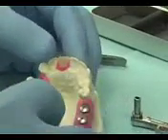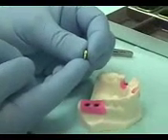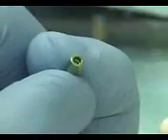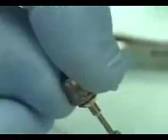What I'm going to do now is, in like manner, remove the healing abutment from our wide neck implants. Now the one difference between the wide neck and the regular neck solid abutment is the wide neck abutment is large enough on the top that the nut driver that you use to remove the healing cap is exactly the same one you can use to place the solid abutment.